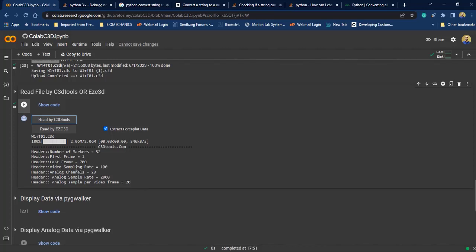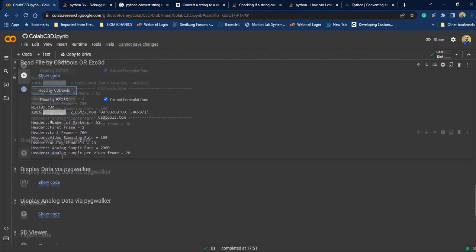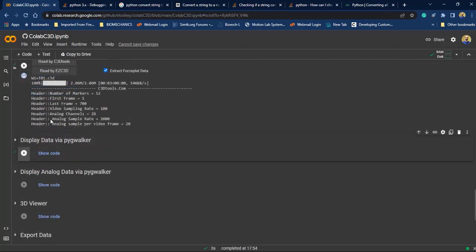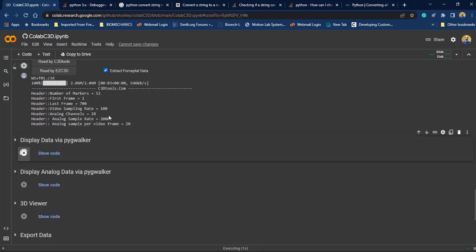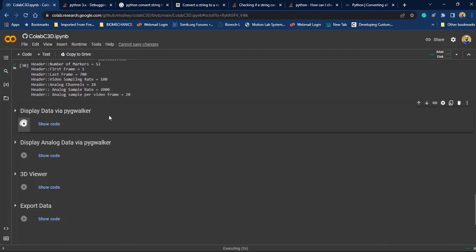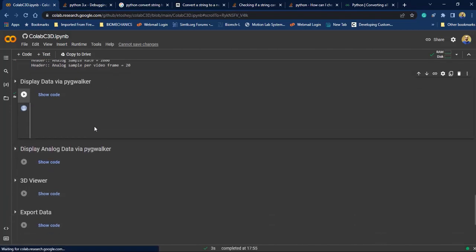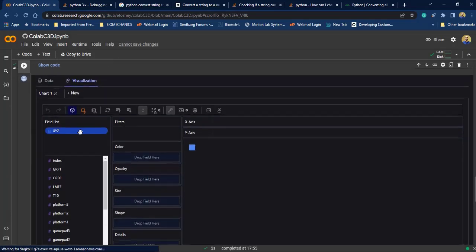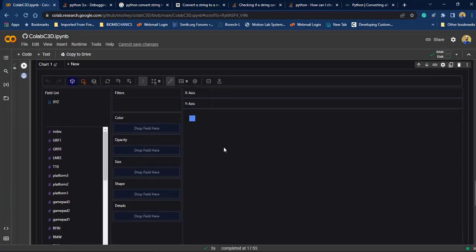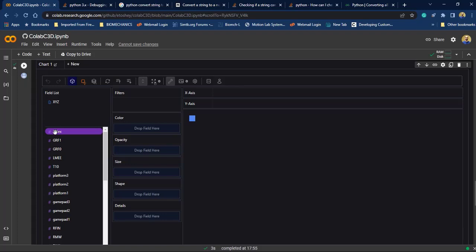Now we can use pyg walker to display the data, so click on this button. As you can see here we can create a customized graph. For example I'm selecting index as the X axis and one of the force plates as the Y axis.